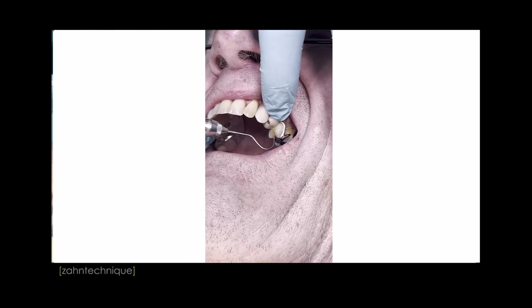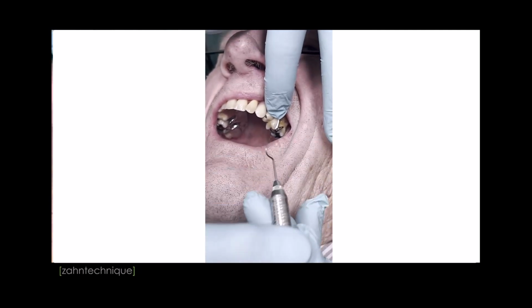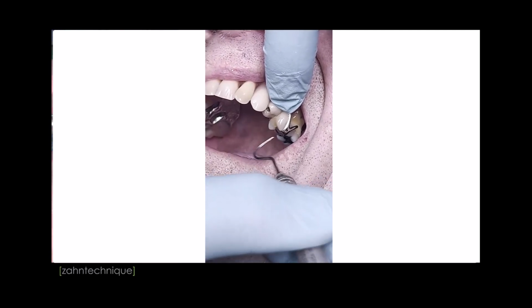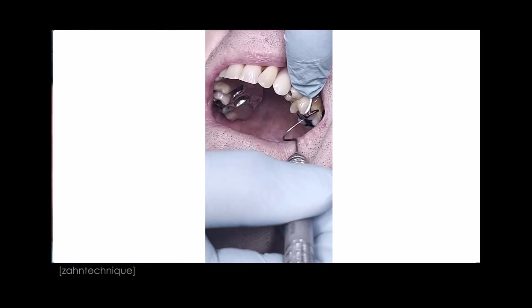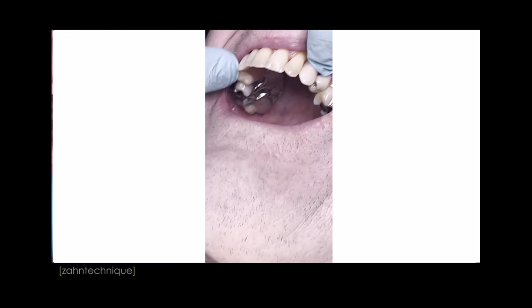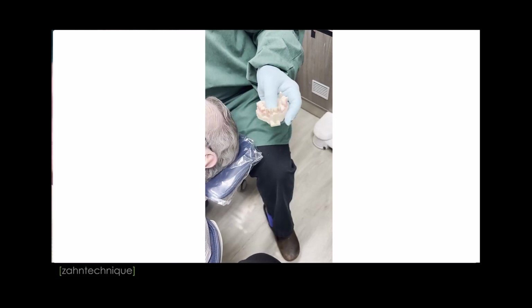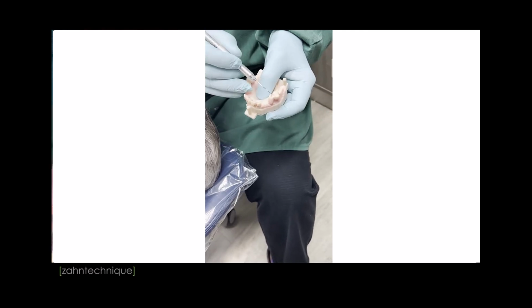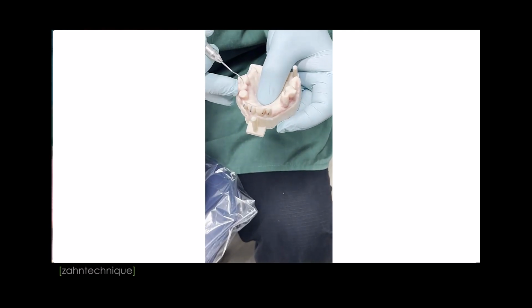I know sometimes some of your colleagues don't have these amazing results with that. My observation is most of the time it comes back to the intraoral scan, not necessarily the material. There's another aspect, and we really have to look into how the partial is manufactured. Is it manufactured from a printed model, or from an intraoral scan? These are two different things, right? We have to definitely see that.